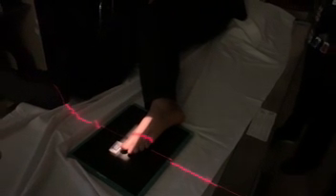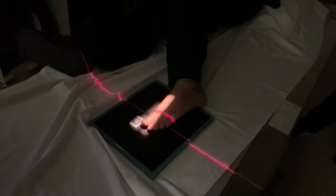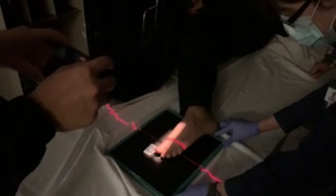I'm just gonna slide you forwards a tiny bit. Yep, there you go. All right. Notice that I'm also back to a straight beam. Okay, so the angled beam is only for your AP. We're going to be using a straight beam for your oblique and your lateral toes. Okay, collimation marker still the same. Sorry, I should probably make the IR look nicer. Okay, there we go.